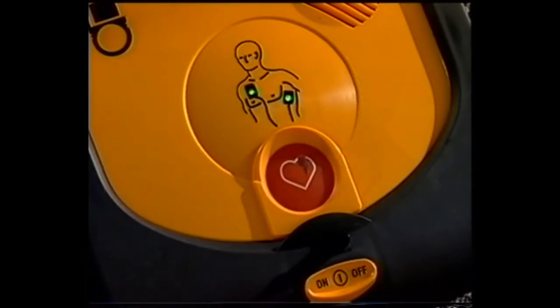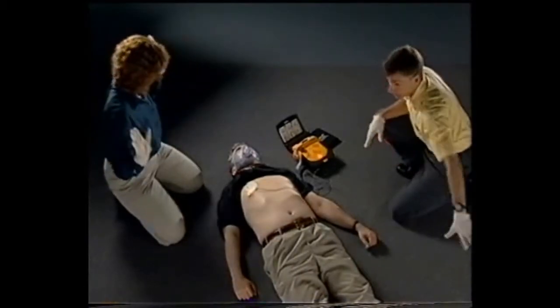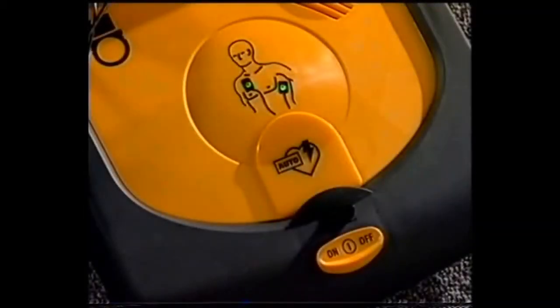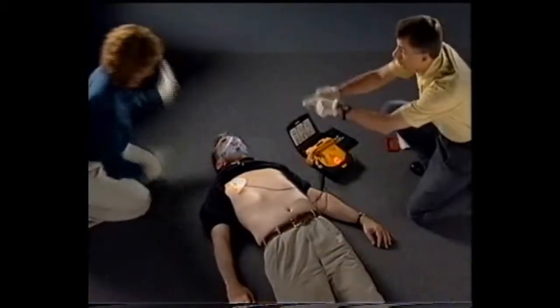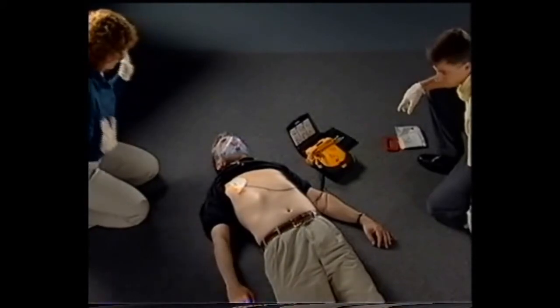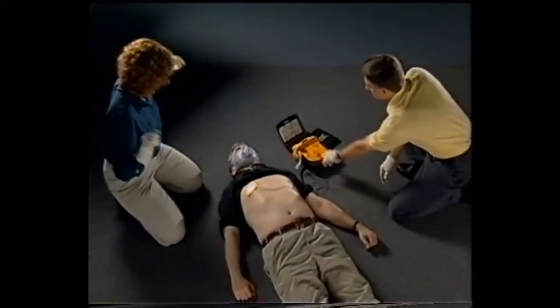"Press flashing button." Check that you and anyone else are not touching the patient, then press the flashing button. "Shock delivered." If you're using the model that does not have a shock button, the defibrillator will say, "Everyone clear. Do not touch patient. Delivering shock." Check that you and anyone else are not touching the patient. This defibrillator model automatically delivers the shock. "Shock delivered."